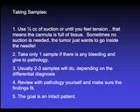Generally, 2 samples are all that is necessary and given to the neuropathologist who is there. If there is any bleeding, I generally take only 1 sample and have the pathologist review this. If the tissue is likely to provide a diagnosis, then no further samples need to be obtained. Again, the goal of the procedure is an intact patient.